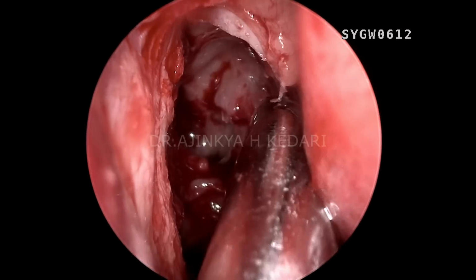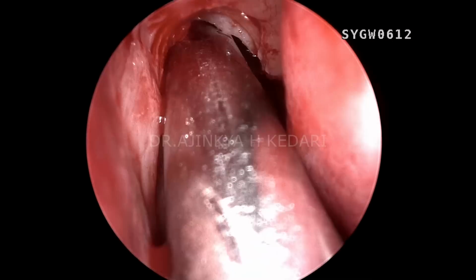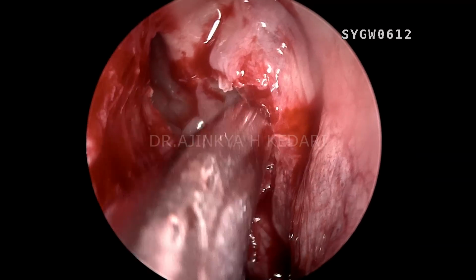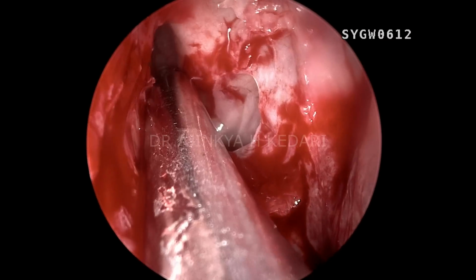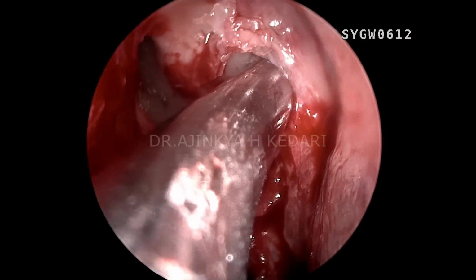You can see that's the agger cell above, along the axilla and the uppermost part of the middle turbinate, anteriorly. So I'm again at the posterior ethmoidal level superiorly, just trying to take away all that soft tissue, just to locate and visualize all the anatomical landmarks.